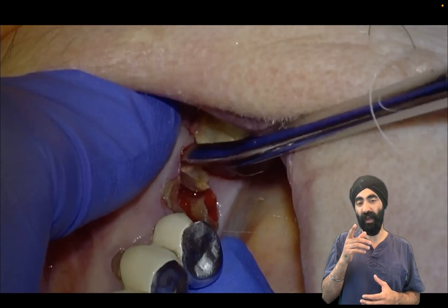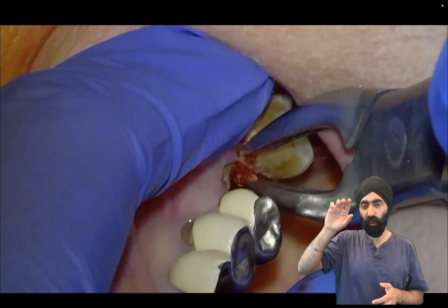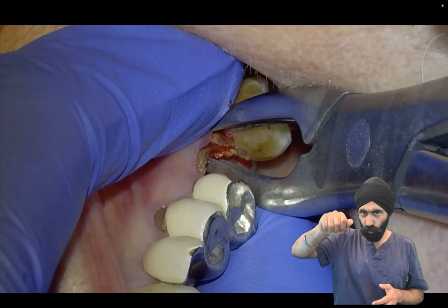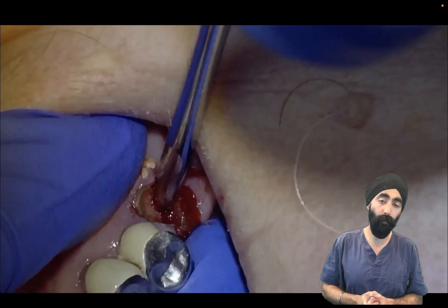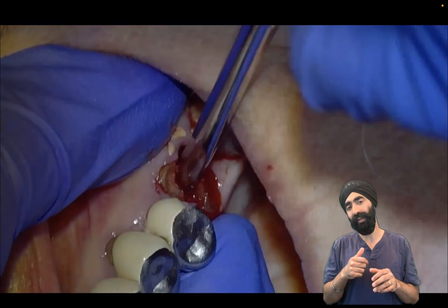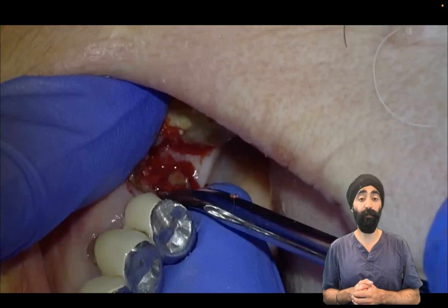Once I get some movement — there we are, lovely movement — I'm ready to get some root forceps on, give it a gentle good grip but a gentle twist. You don't want to overdo it too quick because that's when things fracture. I get a nice movement and there we are, lifted up that disto buccal root. I'm then going to luxate the palatal root, which is looking like it wants to come out next.